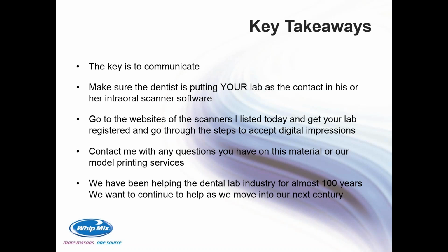So if a doc's in the state of Kentucky and he goes on the iTero lab list, he's going to see his options, or the way he's going to see it is his 2 options in the state of Kentucky. If it's a doc here in Kentucky, he's going to see those as the 2 options for places for him to send iTero cases. So that's just to give you an example, it shows you the importance of making sure you have the ability to accept these digital impressions, and that your doc gets you in there, or is sending you these digital impressions.